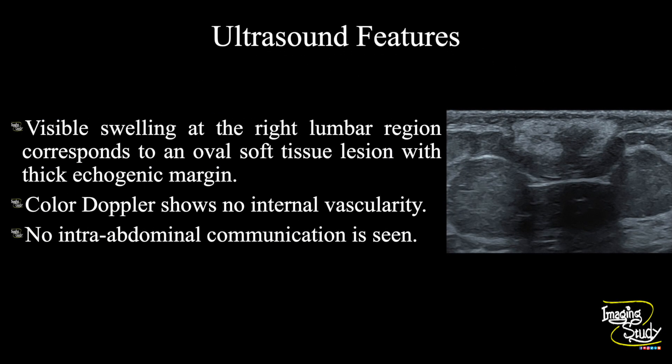In summary, there is a visible swelling at the right lumbar region which is an oval soft tissue lesion with peripheral thick hyperechoic margin. Color Doppler shows no internal vascularity, and there was no intra-abdominal communication or surrounding architectural distortion. So these features conclude this as a case of superficial fat necrosis.